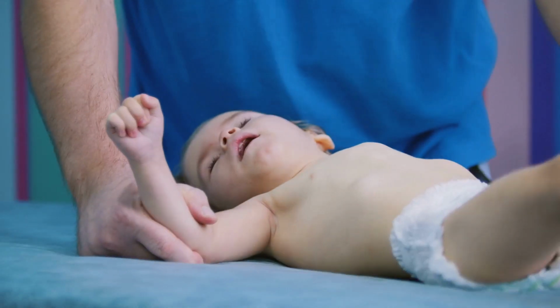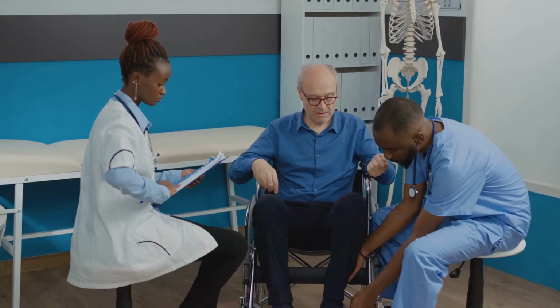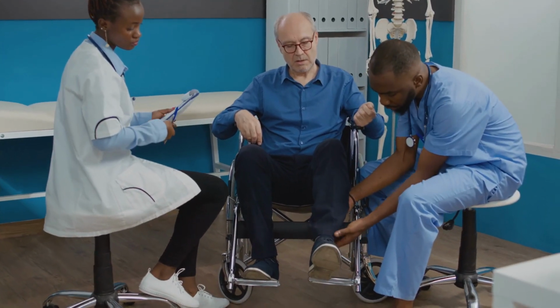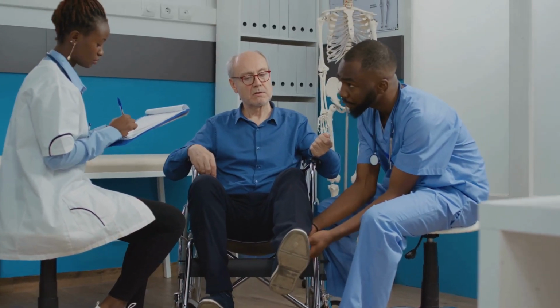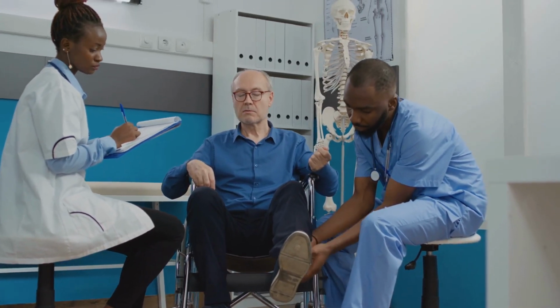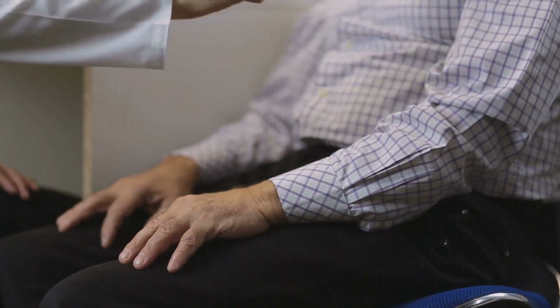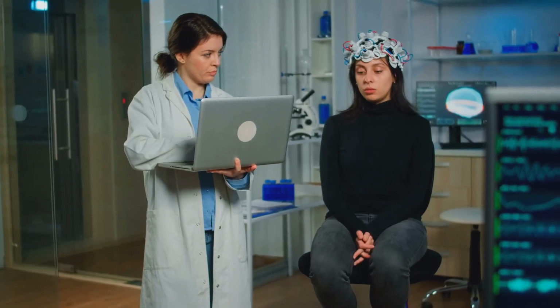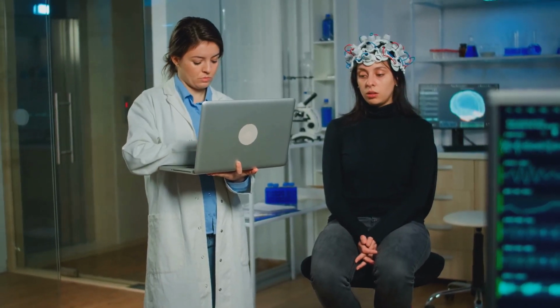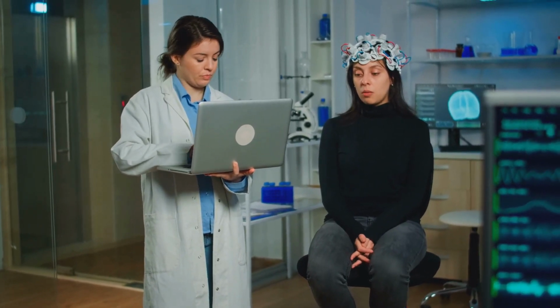Why is this examination so important, you might ask? Well, it assists in identifying any potential motor deficits that may have resulted from the epidural. This could include weakness or paralysis, which may signify nerve damage or complications from the epidural. Additionally, it helps to confirm that the epidural has been successful in numbing the appropriate dermatomes without affecting motor function. This is a crucial balance to strike in ensuring that the patient is comfortable and pain-free, but also safe and able to move.